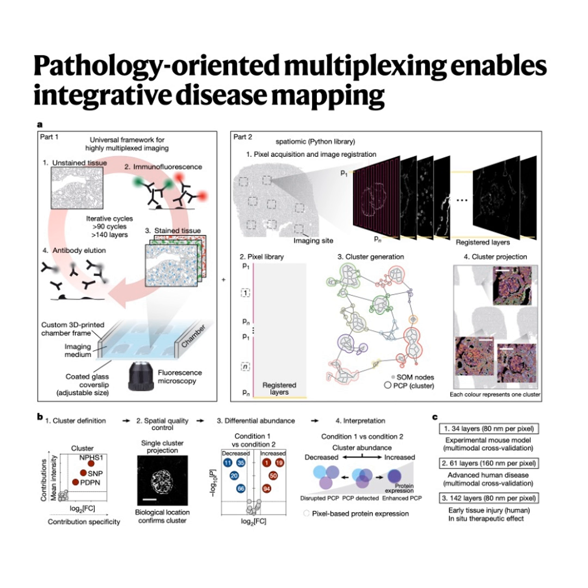NHSE, what does that do? It's a pan-protein label, so instead of just staining the nucleus, it attaches to proteins pretty much everywhere in the tissue. And here's the key. You apply it just once, right at the very beginning, and it stays incredibly stable through all 95 cycles. It acts like a permanent built-in reference grid or a tissue GPS, allowing for really accurate image registration and segmentation across the entire experiment. Okay, so APTs anchors the tissue, NHSE provides the map coordinates.